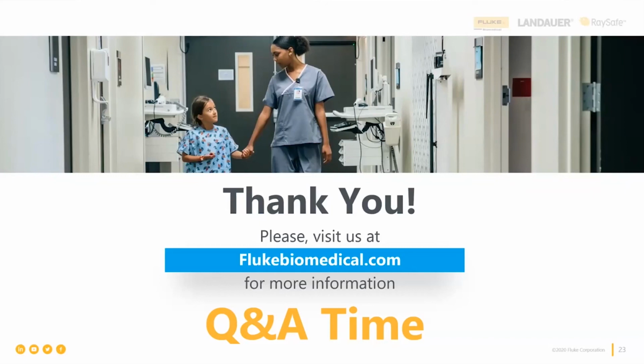That's the durable accessory and the power supply of the AED. That's why you've got to have a spare one way or another that you use to test it with, and don't test it with the clinical battery. I can't think of any AEDs that are one-time use and throwaways. I mean, everyone that I can think of, you replace the batteries, you replace the pads, and you're right back up and running. I've never seen one that had a limitation on how many times it can be used.